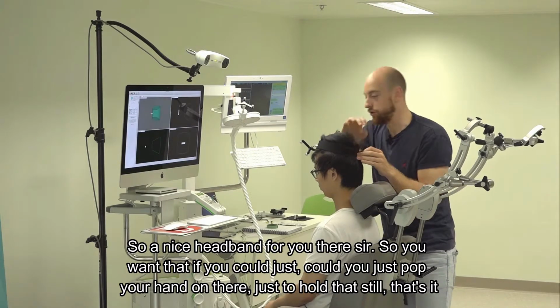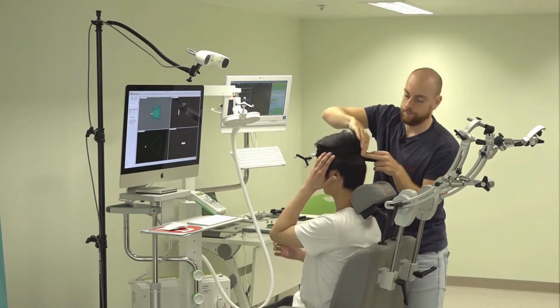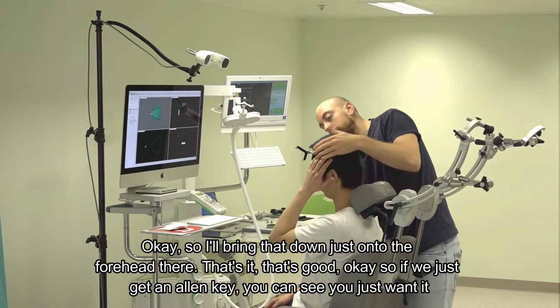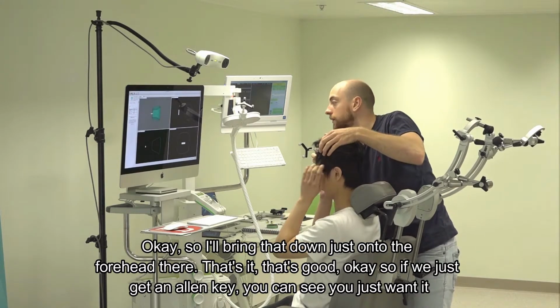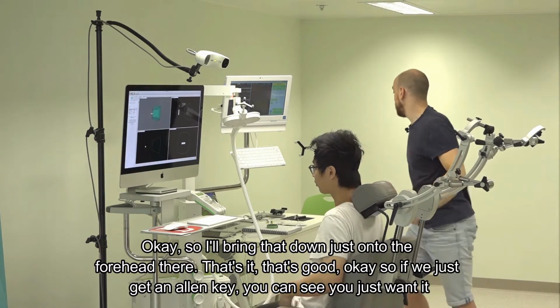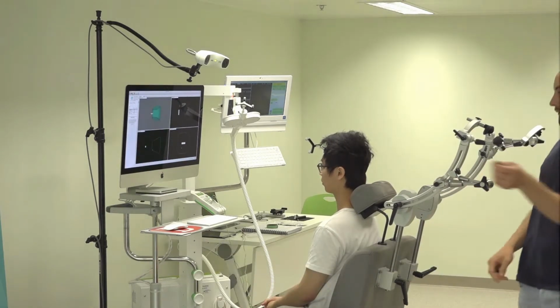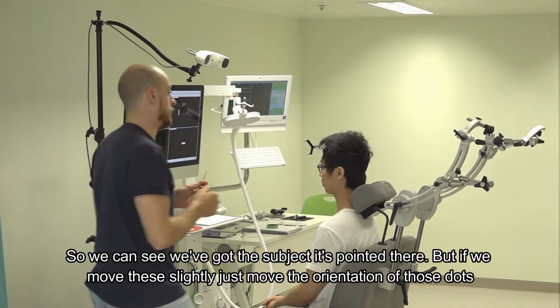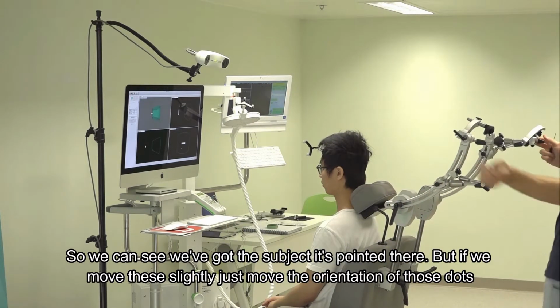If you could just pop your hand on there just to hold that still? That's it. Okay, so I'll bring that down just onto the forehead there. That's good. So if we just get an Allen key, you can see we've got the subject pointed there, but if we move these ever so slightly, just move the orientation of those dots.